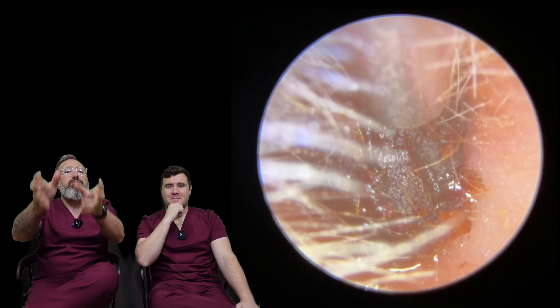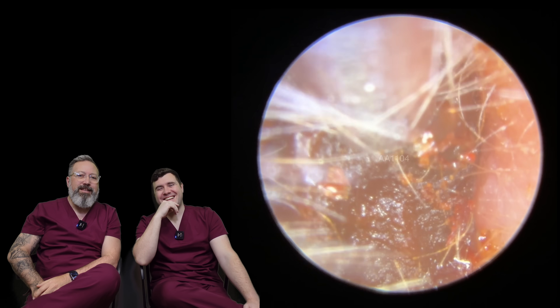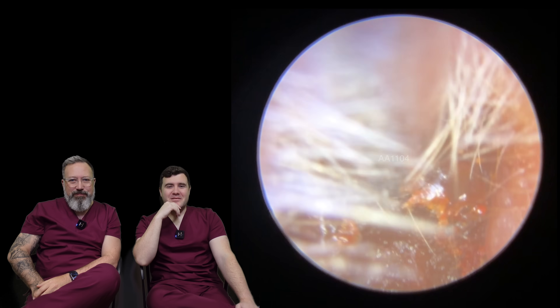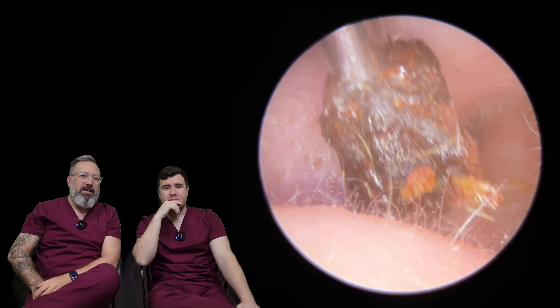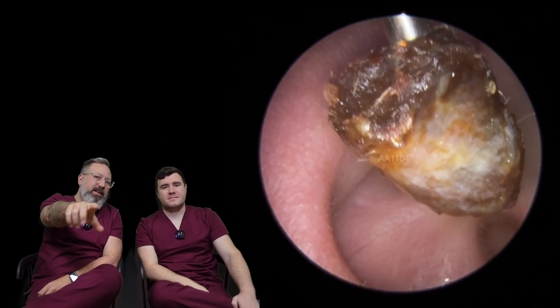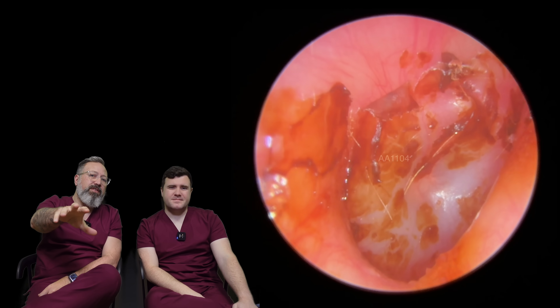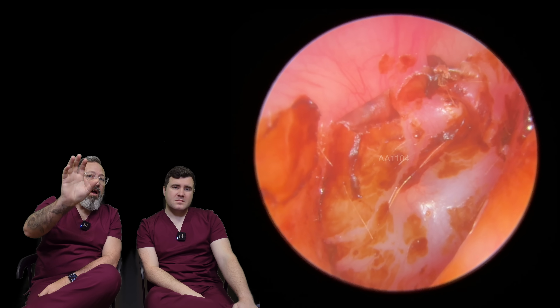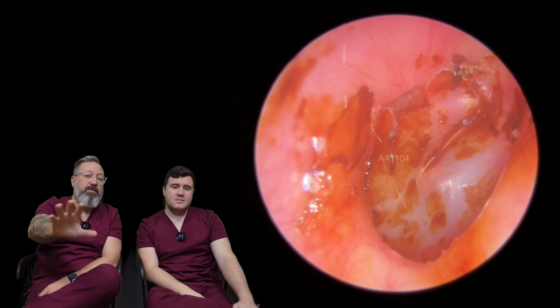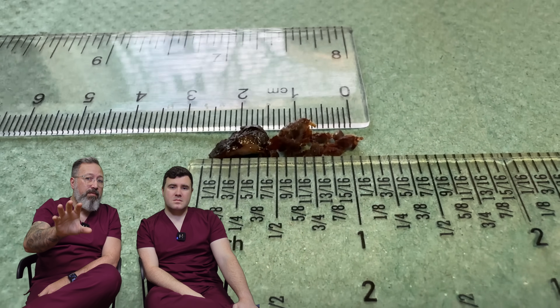And we knew we couldn't push it back further, so we had to bring it out. It's jammed on the outside of the ear canal now — every time! But it's cotton buds. Mum did say that he's been using cotton buds. Well, you can see that layer of dry skin under there. What you'll see now is we've got this very thin layer on the eardrum, but because the patient was so nervous I've left that there for now.